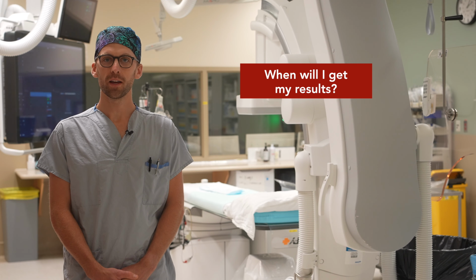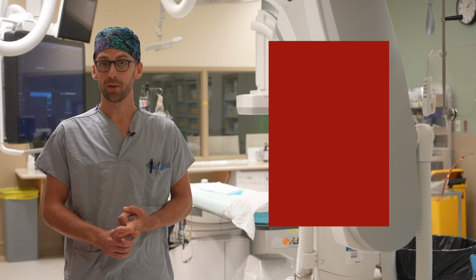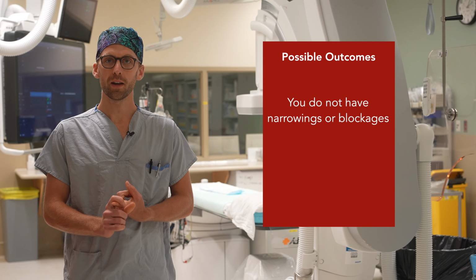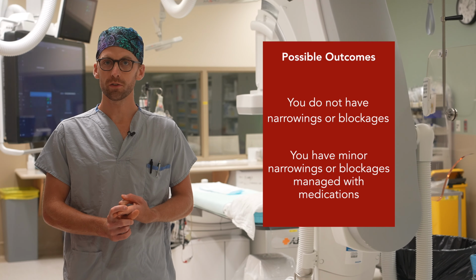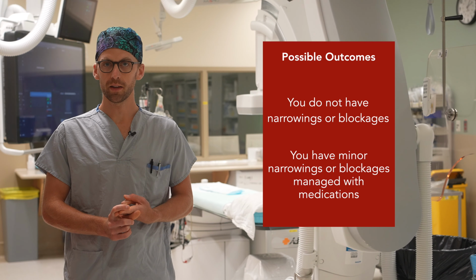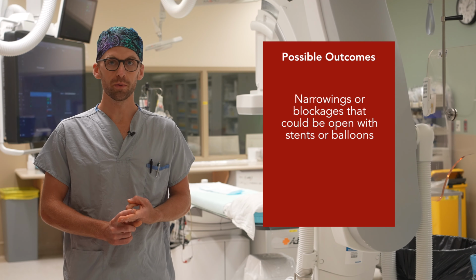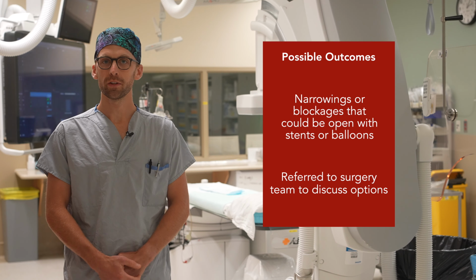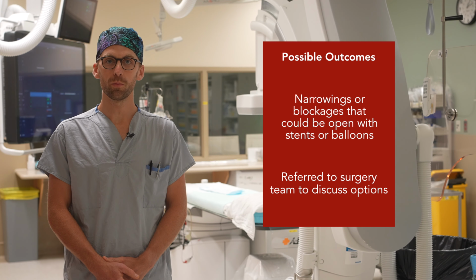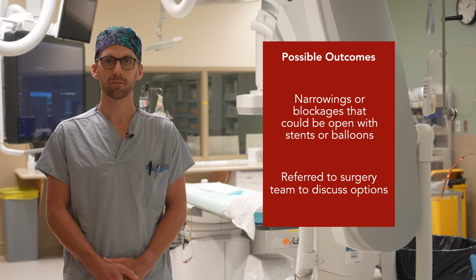As soon as the cardiologist has all the images they need, they will explain the results to you. There are four possible outcomes. First, you do not have heart artery narrowings or blockages. The second, you have minor heart artery narrowings that would best be managed with medications. The third, you have heart artery narrowings or blockages that could be opened with stents or balloons. Lastly, you have heart artery narrowings or blockages that cannot easily be opened with stents or balloons, in which case you will be referred on to the cardiovascular surgery team to discuss your treatment options.